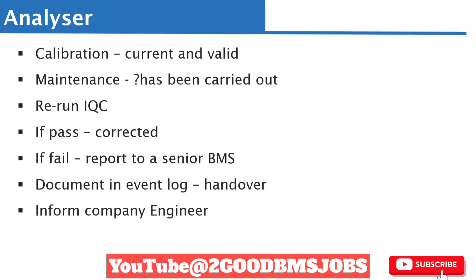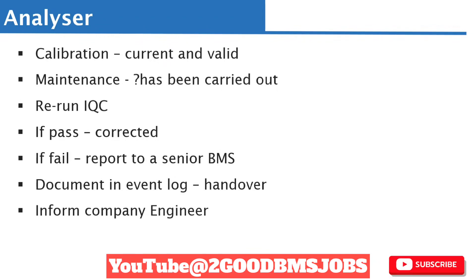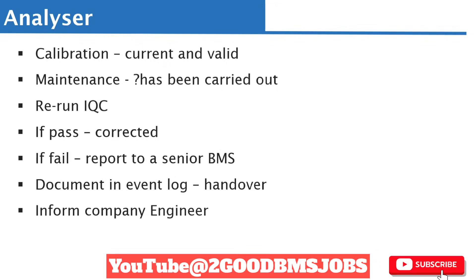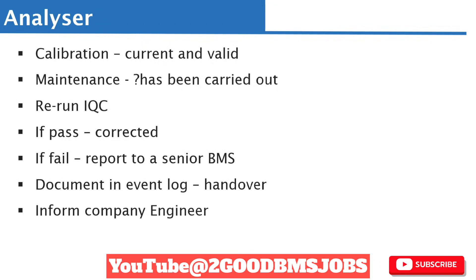Each analyzer has channels, and it's possible that a blood clot can block a channel, or there can even be bacterial growth on the channel that contaminates it and affects the quality control result. That is why maintenance involves flushing and washing the channels, and doing background checks to ensure nothing will interfere with the result. If maintenance fails, there may be an underlying cause that needs to be sorted out. Once maintenance and calibration pass, you can rerun the quality control.